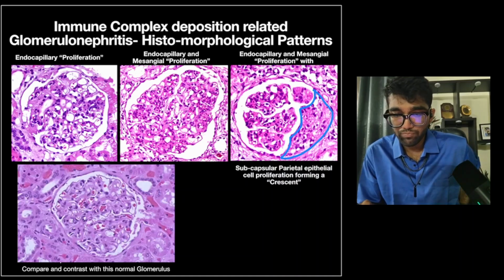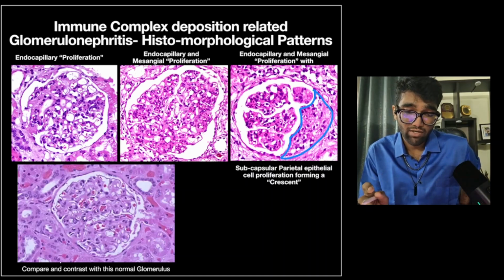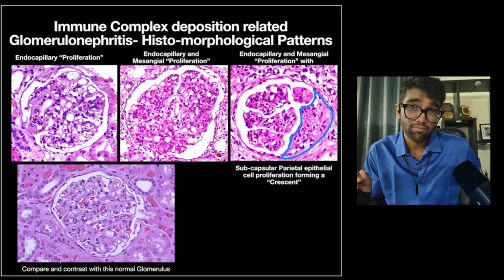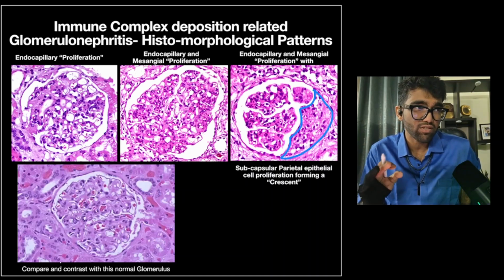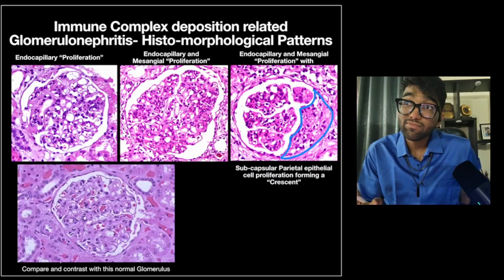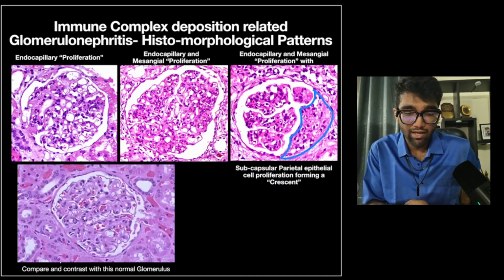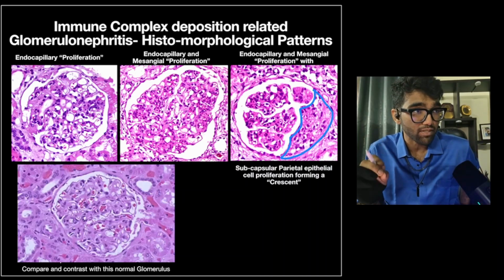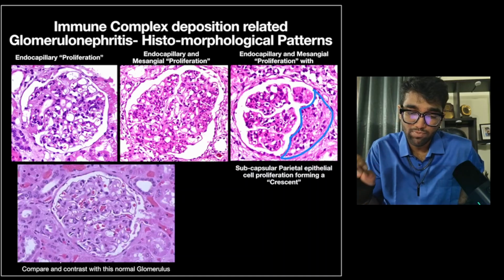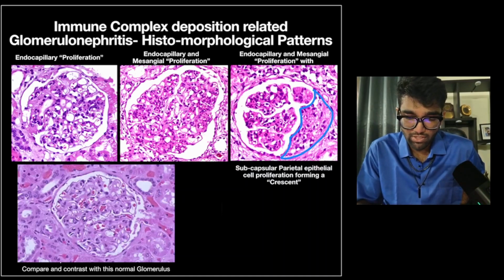Okay, so now see, all three of these imaging findings have occurred due to antigen antibody complex deposition subendothelially, with or without some deposition in the mesangium. But therefore, these entities can occur in different glomeruli of the same biopsy specimen, that is, different glomeruli within the same biopsy taken from the same patient. Okay, so they form a spectrum of changes or morphological changes.